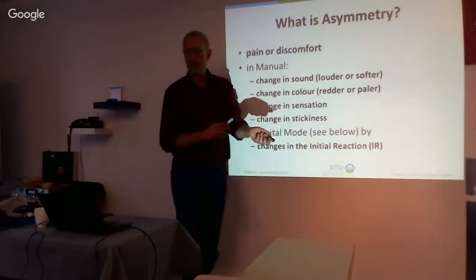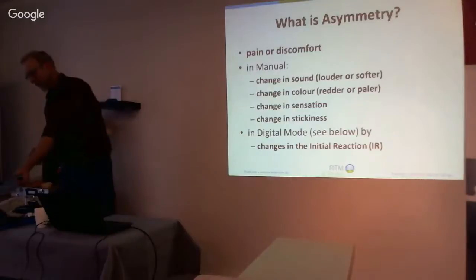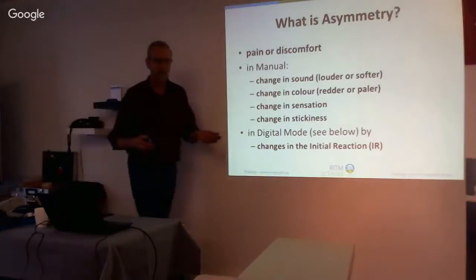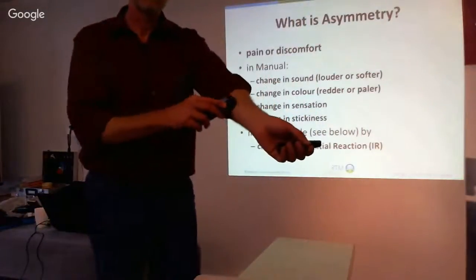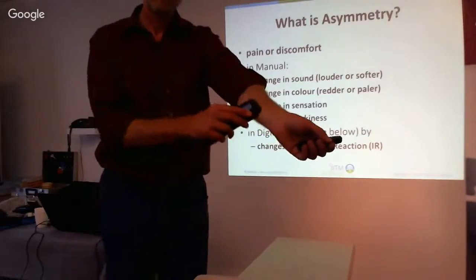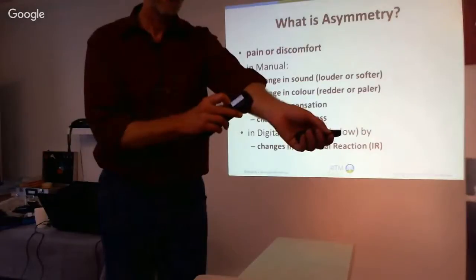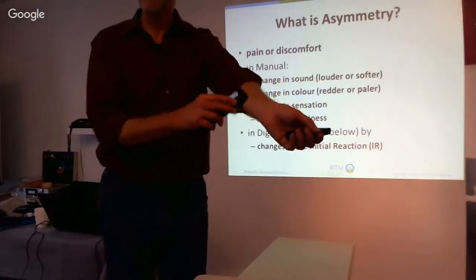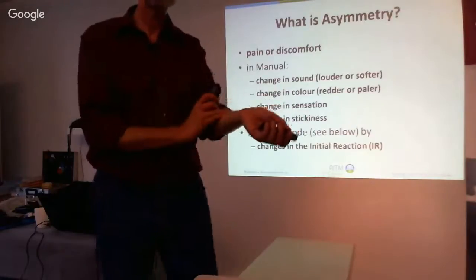I don't know whether the microphone might pick this up, but you can hear the sound coming along. Show, please. When I put it on my arm, you probably can't hear it now. Go a little bit higher. Then you actually get a sound.